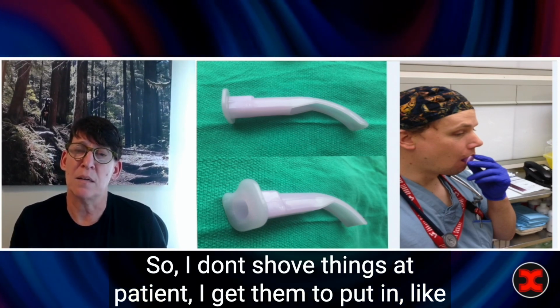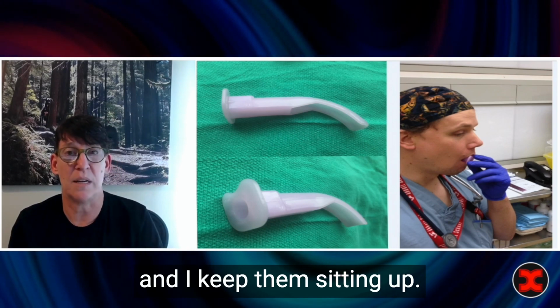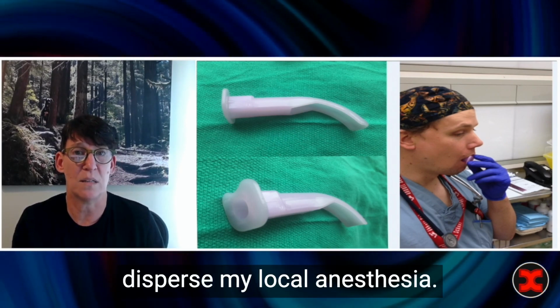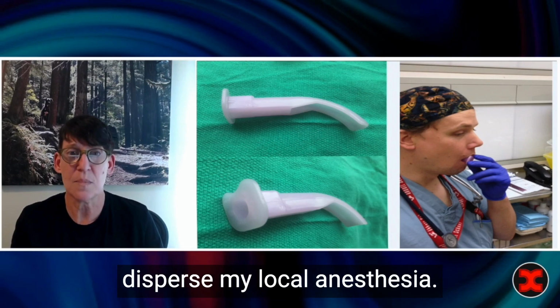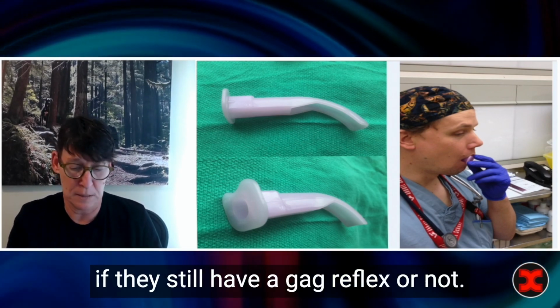So I don't shove things at patients. I get them to put it in. I give them a Yankauer in their hand while we're doing this, and I keep them sitting up. I keep them on nasal oxygen, not a huge high flow because it'll disperse my local anesthesia, maybe about 4 liters per minute, and get them to try with a Yankauer to see if they still have a gag reflex or not.